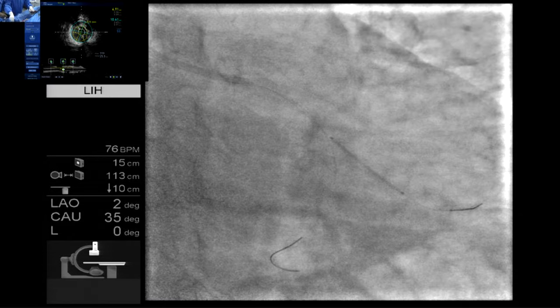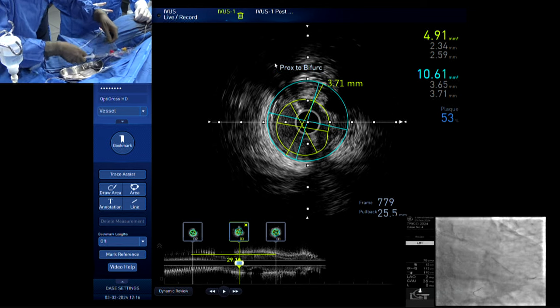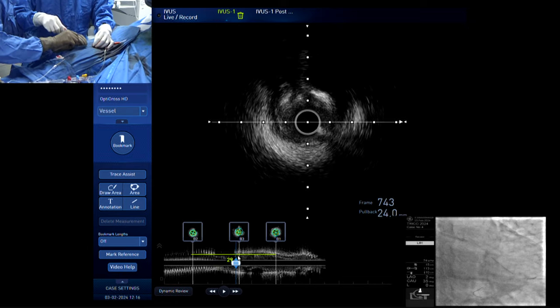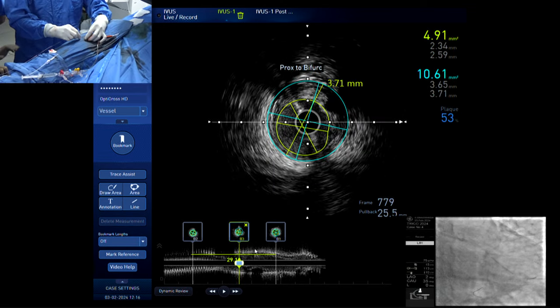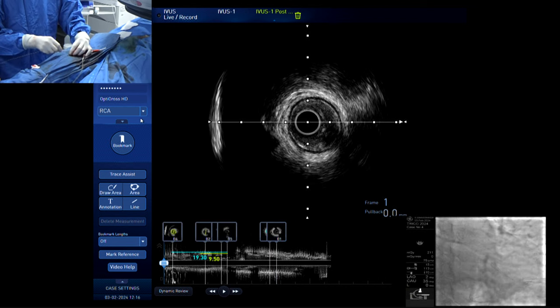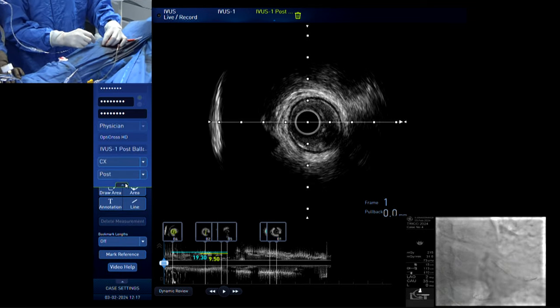This is the main branch, okay? So let me make this a side branch. The side branch ostium is not always spherical. It is probably like a cone. So would you post-dilate just the ostium with a balloon much larger than the stent? Post-dilate the side branch stent? Yes, the ostium of the side branch stent. Well, we need to crush it first, right? I mean, right now it's dilated. You're talking about the ostium bigger than the stent, 2.5? Yeah, because then it would appose all around the ostium of the side branch, the ostium of the OM. And then we can crush rather than just... Okay, I will show you my technique, how to do some good apposition. Thank you. That's a good point. Apposition is very important for the side branch ostium.